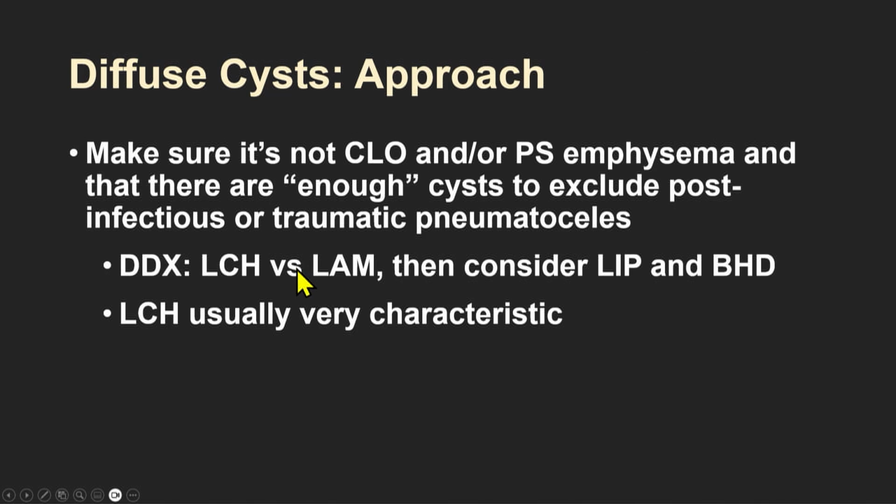Before we talk about the specific cystic lung diseases, very seldom will these patients come in with a stamp of a diagnosis, right? Some patients come in with a known history of cystic fibrosis, or they'll come in with known emphysema. Those are pretty easy diagnoses to make because they already have the diagnosis in hand. A lot of these patients with cystic lung disease come in with just non-specific symptoms, or maybe you got a CT for another reason, maybe a lung cancer screening CT, and they clearly have some sort of cystic lung disease phenotype. How do you approach this?